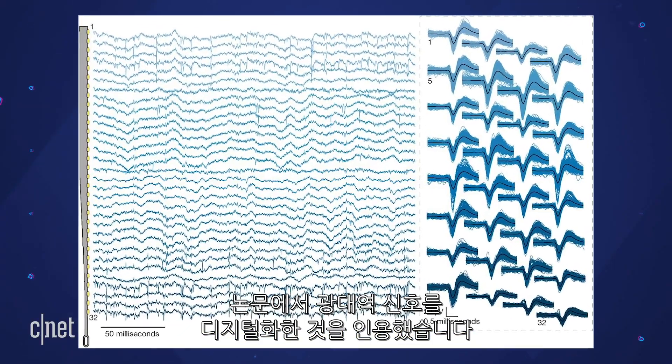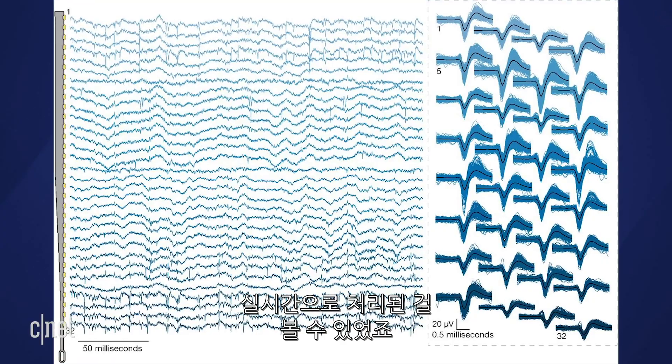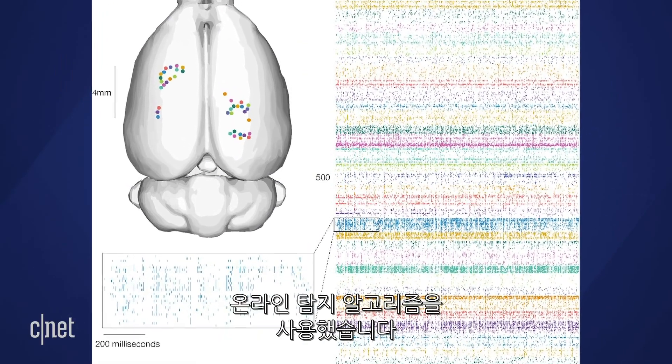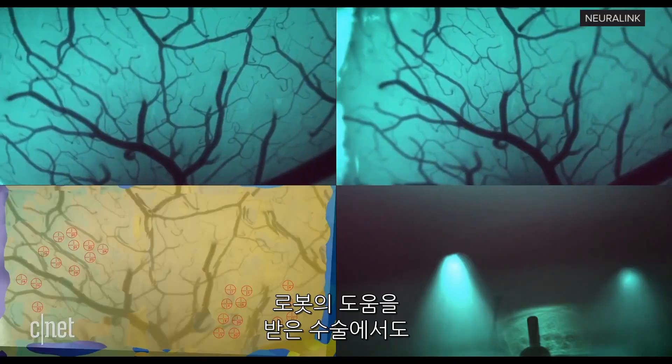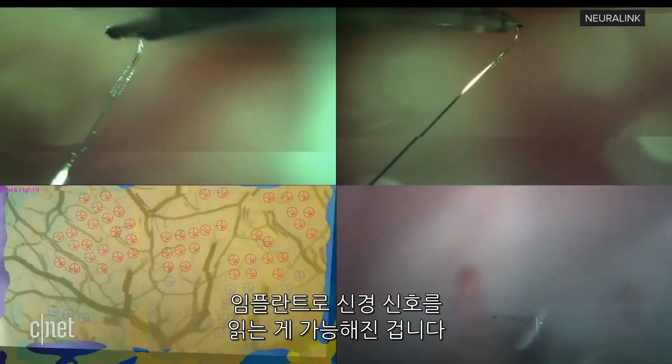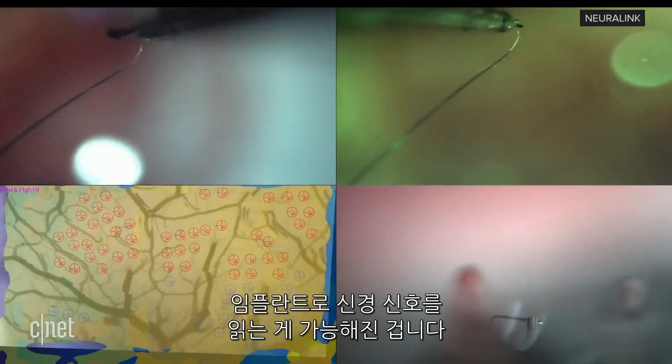The paper says, quote, 'digitized broadband signals were processed in real-time to identify action potentials — spikes — using an online detection algorithm.' With the robot-assisted surgery, Neuralink says it implanted this tech while minimizing bleeding and reducing the risk of harming cortical vessels. So the implant is definitely capable of reading neural signals.